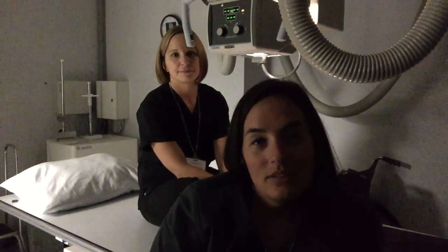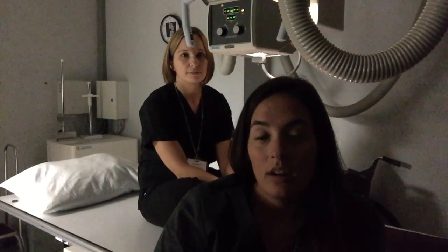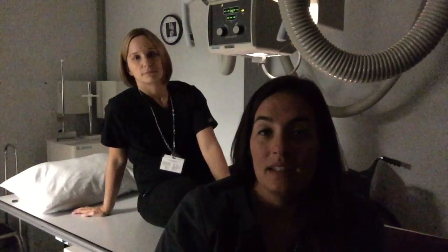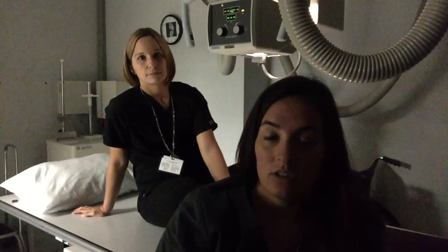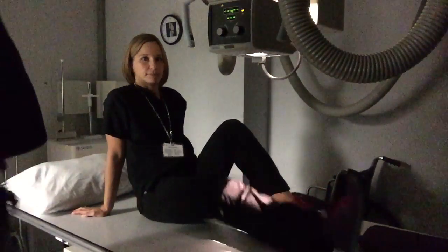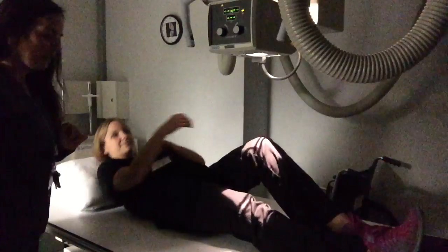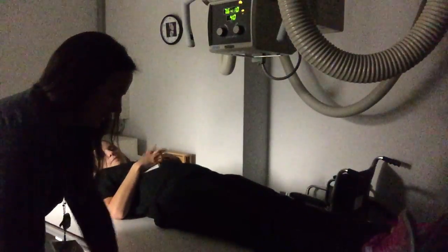Hello, we are going to be doing today your instructional video for your knee views. For your practical, you'll be doing an AP and lateral, so we'll be demonstrating those here for this instructional first. I'm going to start with Mrs. Skaggs being my patient, having a right knee injury with her laying back onto her back, right on this table here. And I'm going to be using a 10 by 12 cassette.